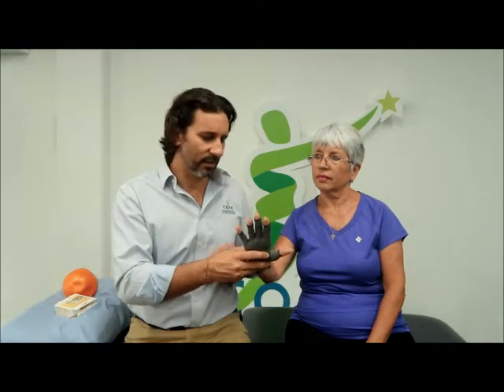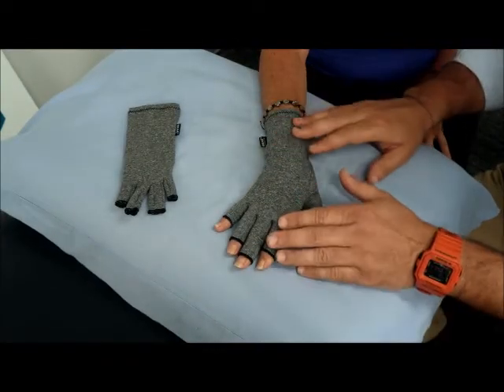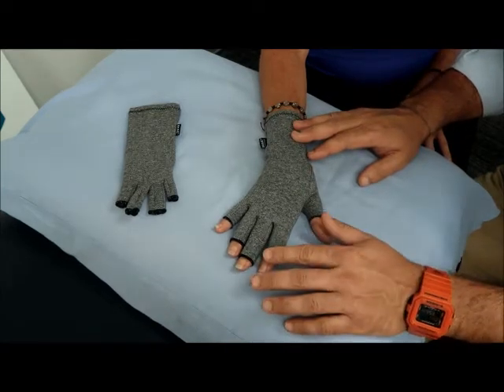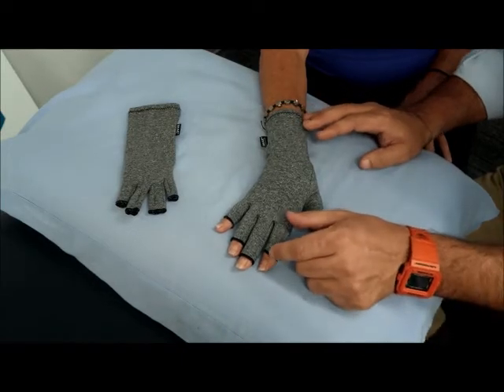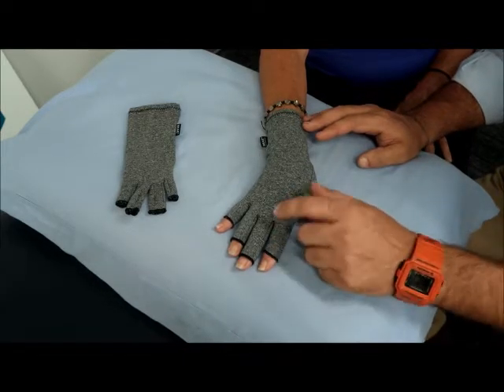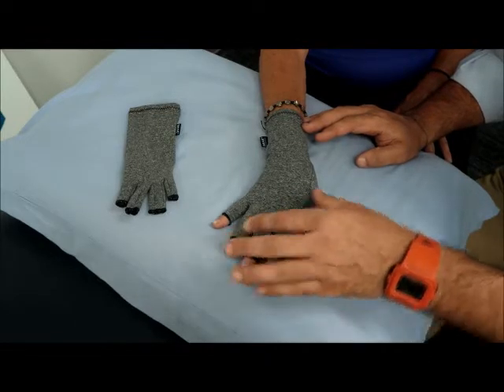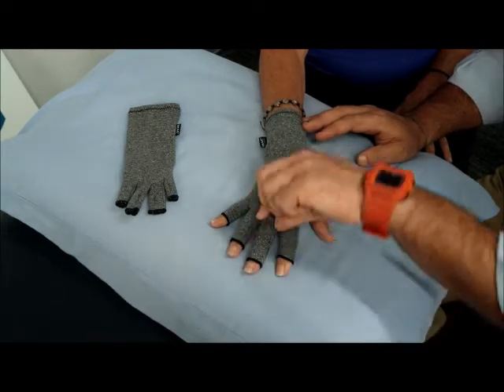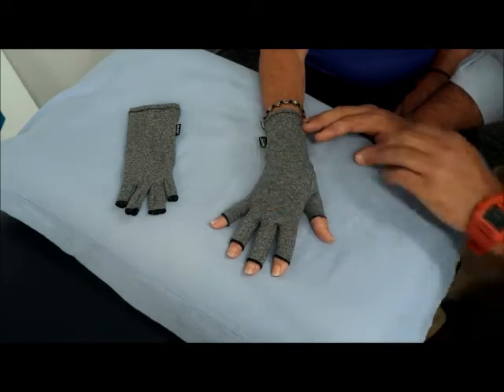Looking at the arthritis glove now — as we said it's fingerless — so you can see that it's covering every joint. Even the top joints of the finger are covered, but you still have your fingertips to be able to feel things. The finger compressive sections are quite long. You can see there are seams along here which means that the glove fits snugly and fits around the joints, and it's actually quite compressive, really down on the hand, which is great.